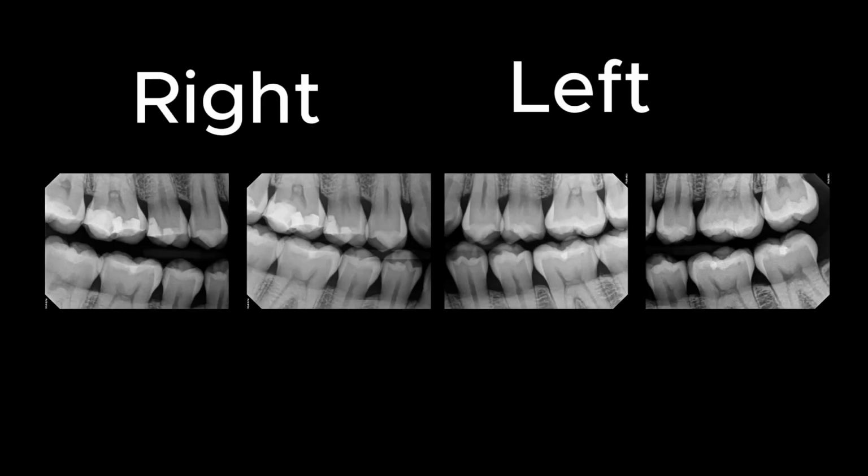We're going to look at these bite wing images and talk about the structures that we're trying to capture when taking a good bite wing x-ray. On a premolar view, we're trying to get the maxillary and the mandibular canine in the image. We're trying to get the distal of that canine in the image. We're also trying to open the contacts, and we're trying to get the bone levels of both the max and the mandibular jaw in the image.